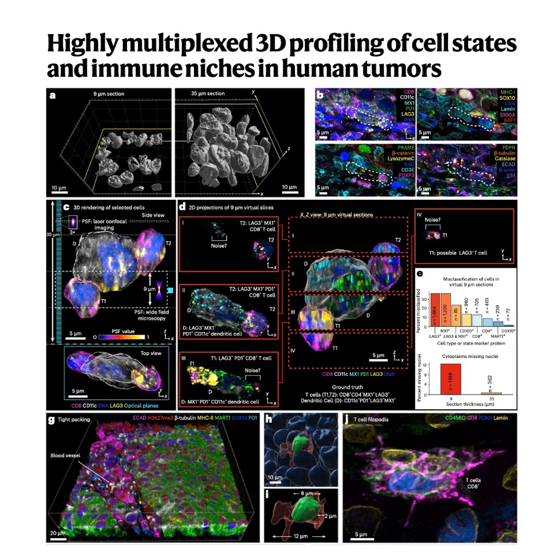Okay, and one final major finding related to mapping function to location. This 3D approach allowed them to pinpoint the very beginning of cancer spread, connecting inflammation directly to the act of invasion. That's right. Within the melanoma samples, specifically in an area called the melanoma in situ, MIS, region, they found these very distinct localized domains, maybe 50 to 100 micrometers in diameter. These small niches were characterized by highly active interferon signaling, a key inflammatory pathway. They could see elevated levels of proteins like IRF1, MX1, and MHC class I, all indicators of interferon activity. So little hotspots of inflammation.